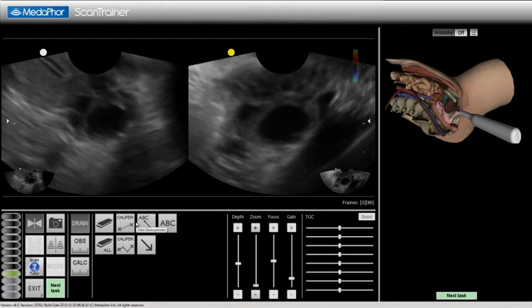Measure the left ovary in the coronal plane. On the left half of the screen, showing the coronal ultrasound image, I measure the maximum diameter of the left ovary from the right side to the left side of the patient. I then keep the ultrasound image frozen.